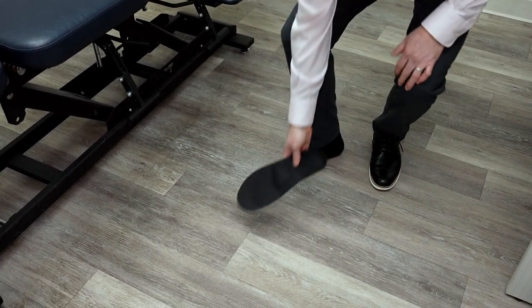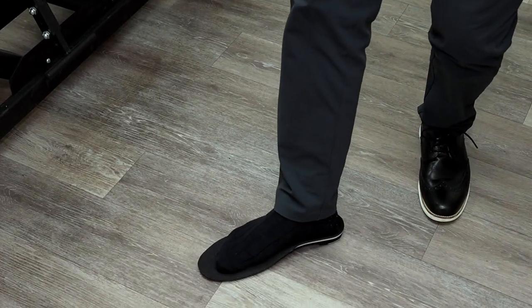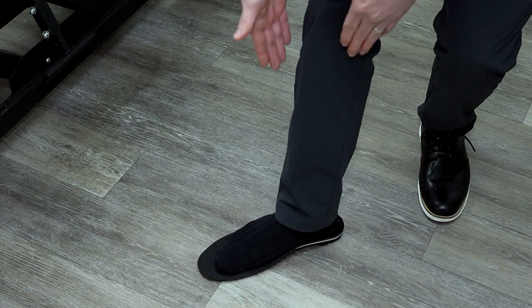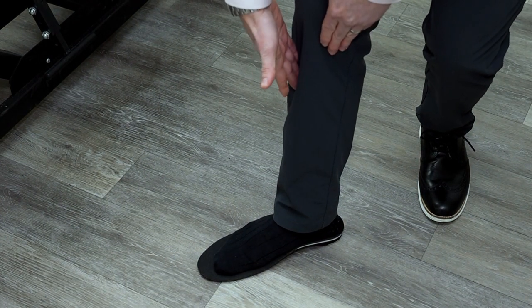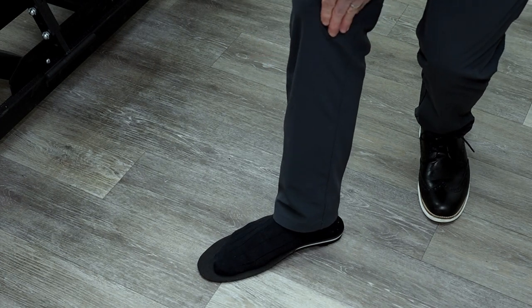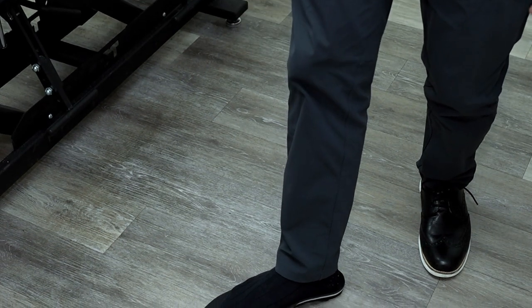The way orthotics work is they raise the medial arch of the foot to slow down or decrease the rate of overpronation, causing the tibia not to rotate as much internally. This takes pressure off the inside of the knee, which could help with knee pain and even hip pain or low back pain.